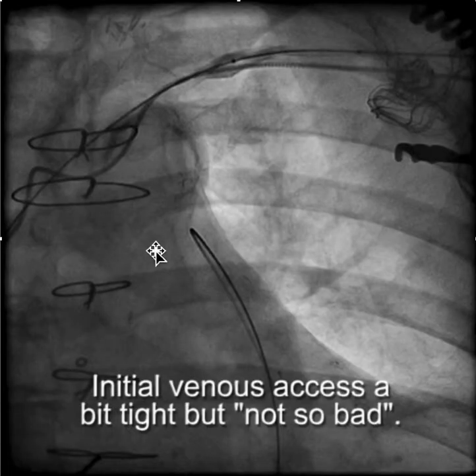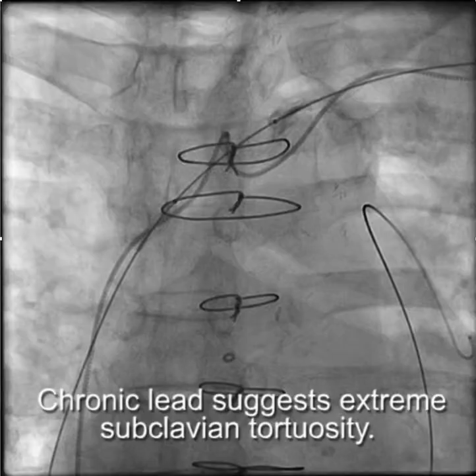The initial venogram wasn't particularly remarkable. The wire went down easily and the sheath went down without too much difficulty. It was noted that the chronic lead had quite a tortuous course, suggesting venous tortuosity, but it didn't seem to be such a big deal.